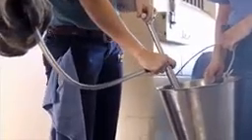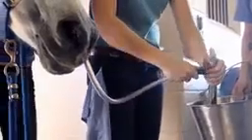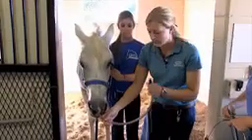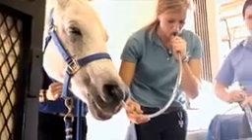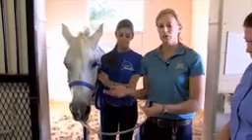So I'll put usually 8 pumps of water in here. And then when you disconnect the tube here, you don't always get a siphon right away like that. Something that you can try to do is just put a little pressure on the tube and try to start to get feed contents from the stomach. And you can see there that there were a little bit of feed particles in there. And if all you were doing is giving a medication, that would probably be enough to confirm that you're in the stomach, and you can go ahead and give a medication.